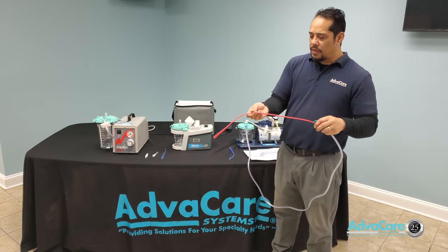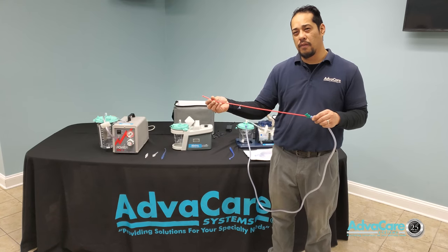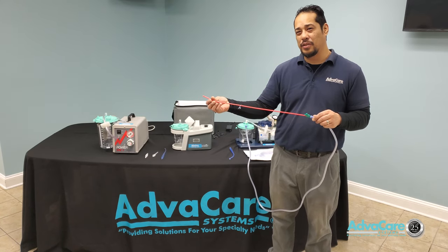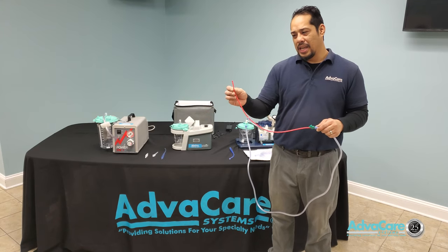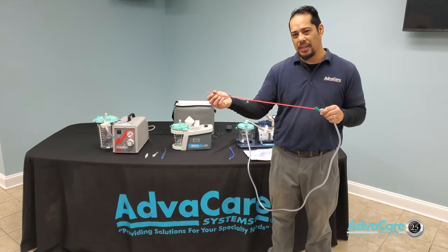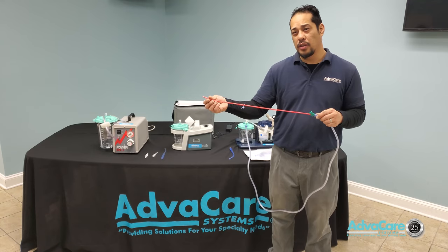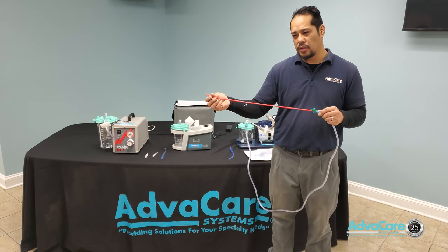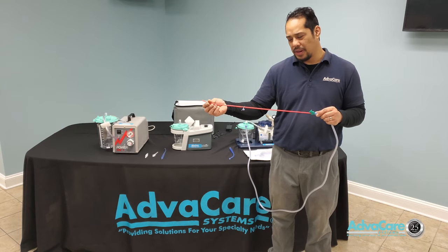Catheters come in different sizes: 6, 8, 10, 12, 14, 16, 18, 20, 22. The number represents the thickness of the tubing and the inner diameter. The larger the number, the thicker the tubing and the larger the inner diameter.